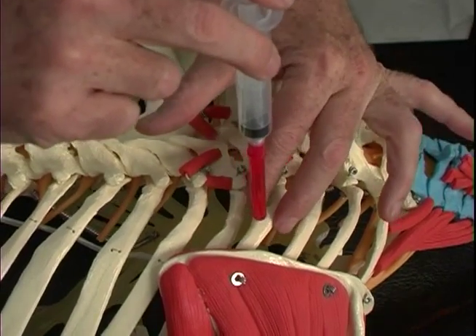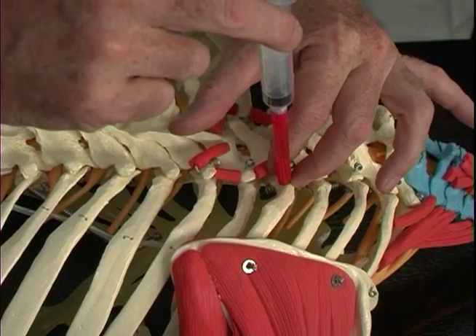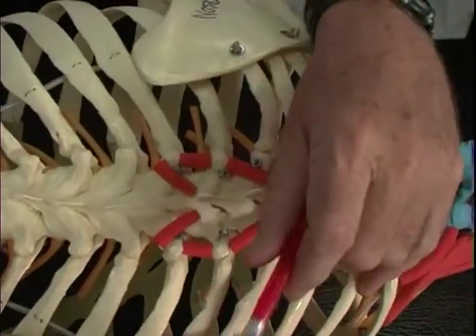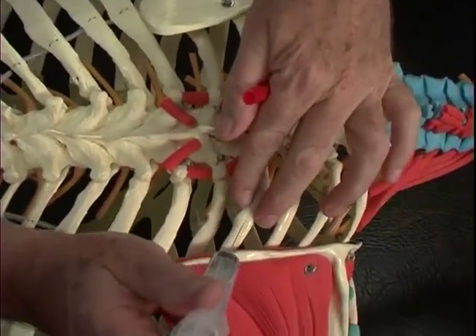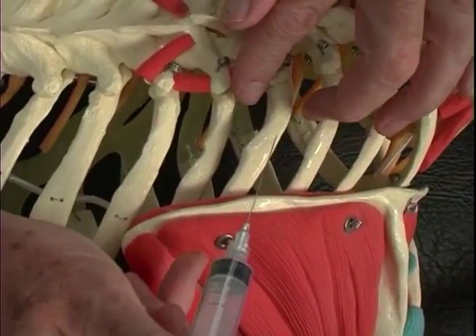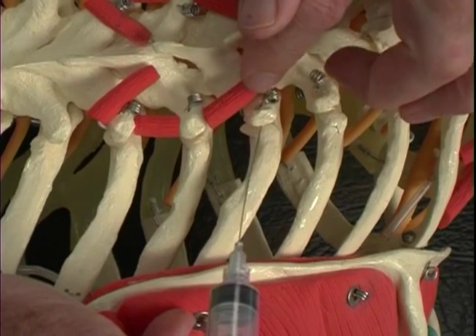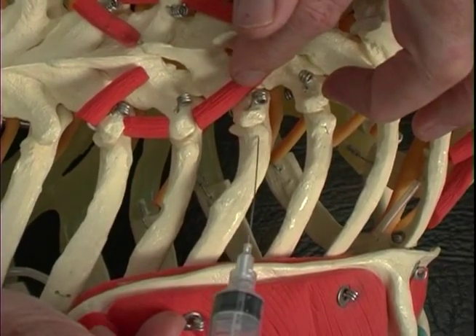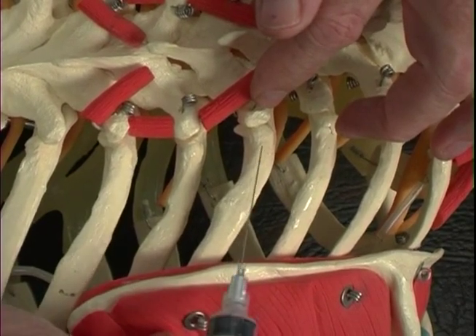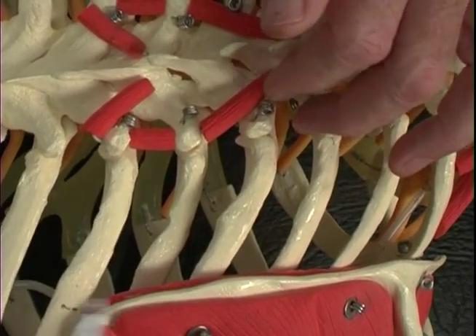Alternatively, we mentioned that we can slide the needle across, doing a needle slide technique or a skin sliding technique, and slide the needle across as we go with our injections. And a final technique, which will be demonstrated in one of our videos, is to come into the angle of the rib and then bend the needle as we're coming across, bend the needle in and slide the needle across the rib like this, injecting small amounts of solution as we go till we get to the rib transverse process junction, where we then inject that area. This is an advanced technique, but I certainly would not recommend it initially when we're doing prolotherapy.